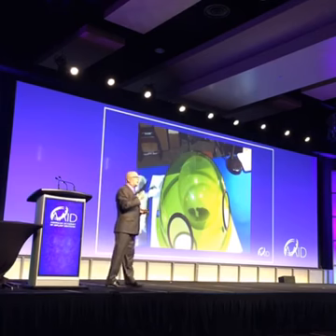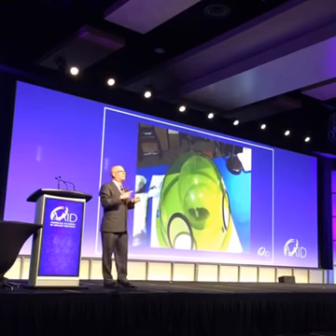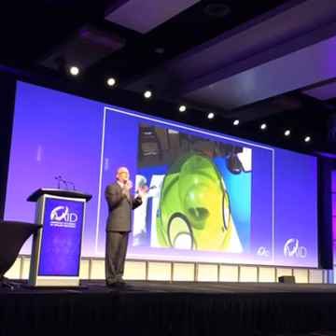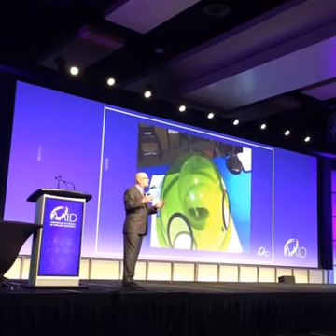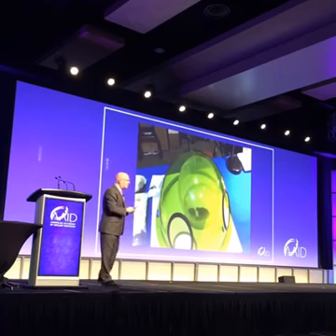Nd:YAGs, however, are not absorbed in water, so they'll pass right through, kind of like the balloon. It passes through the balloon to reach its target, which happens to be dark pigment, dark tissue, inflamed tissue, pigmented bacteria, etc. So it can pass through cells to get to its target without damaging the cell itself. So it's not going to remove non-diseased tissue. It's really only going to remove diseased tissue. It's also moderately absorbed in hemoglobin, which allows us to develop fibrin clots, which you'll see a little later.